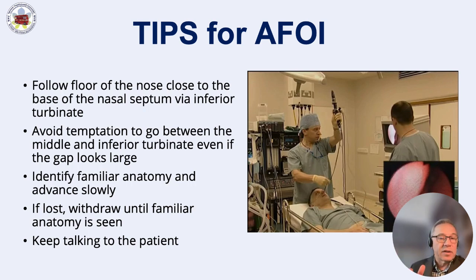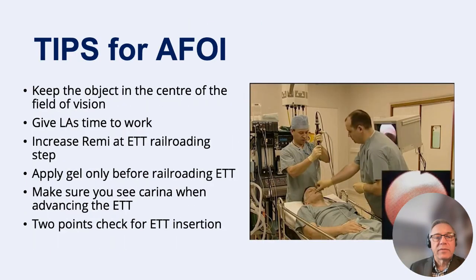If you cannot answer, where am I? I don't know. What I'm looking at, no idea. What I'm going to see next, again, no idea. You're lost. Withdraw, start again. Not completely withdraw, but withdraw until you recognize something. And then keep talking to the patient, making sure that your patient is awake and breathing, because the whole point of this technique is for the patient to continue breathing.